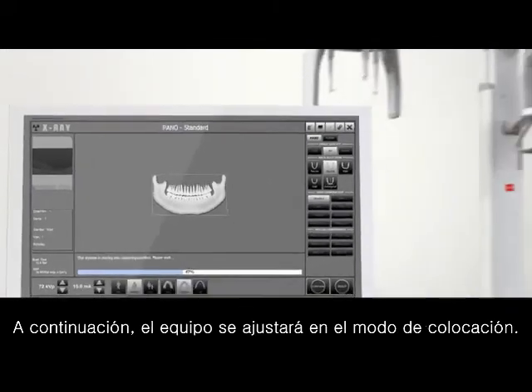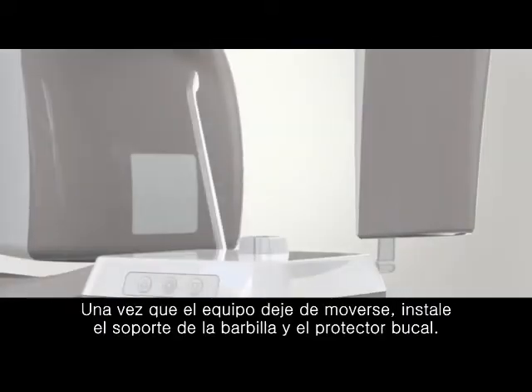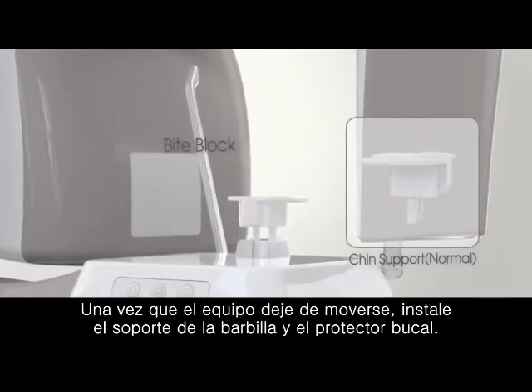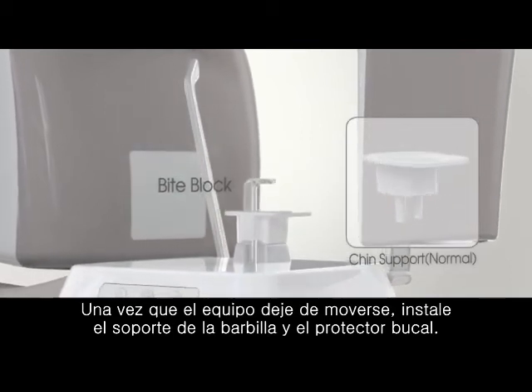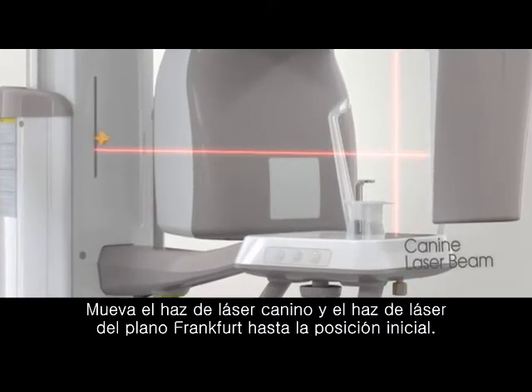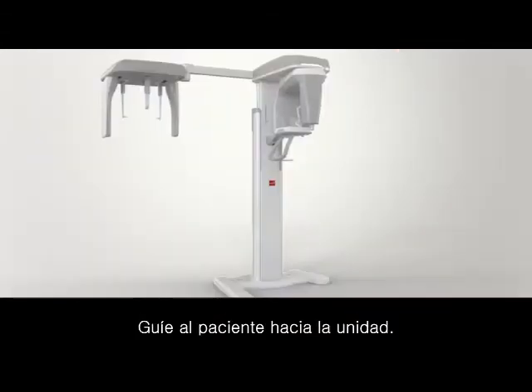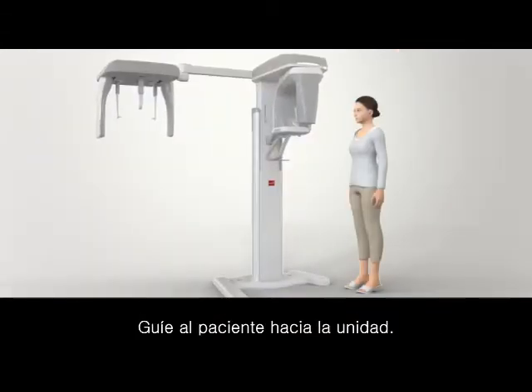Then the equipment will set in positioning mode. After the equipment stops moving, install the chin support and bite block. Move the canine laser beam and the Frankfurt plane laser beam to the initial position. Guide the patient to the unit.